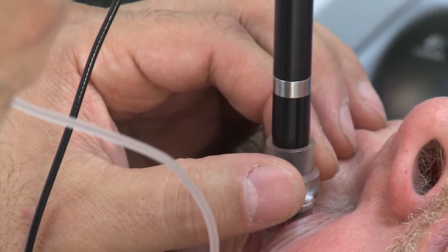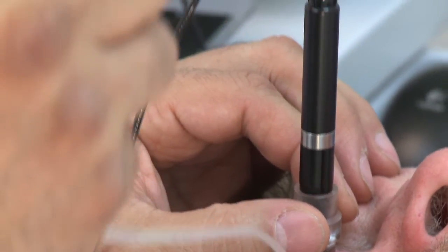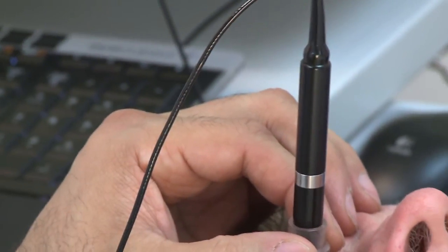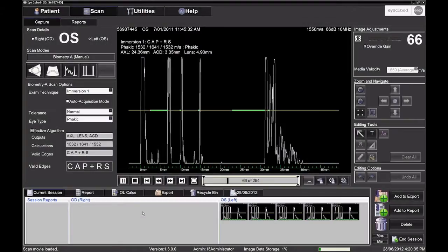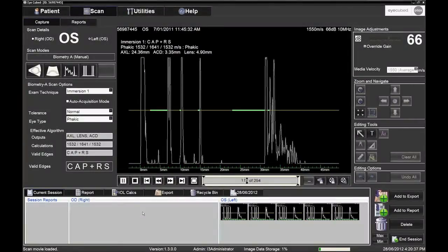Gently squeeze the BSS bottle so that the shell fills with BSS and an echogram appears on the screen.